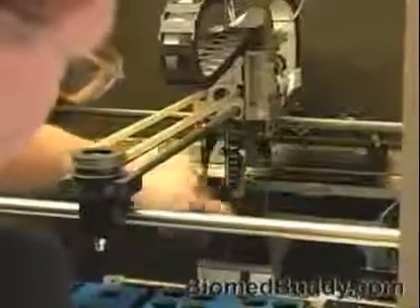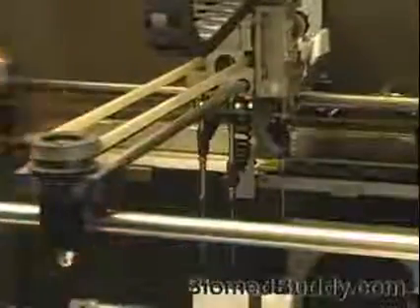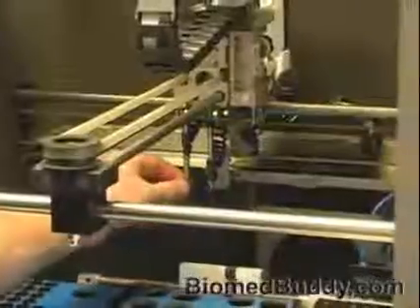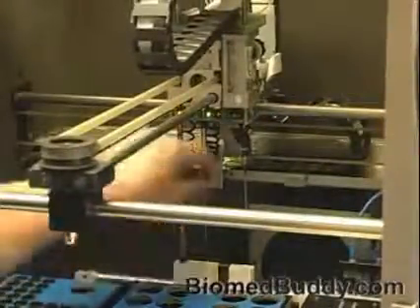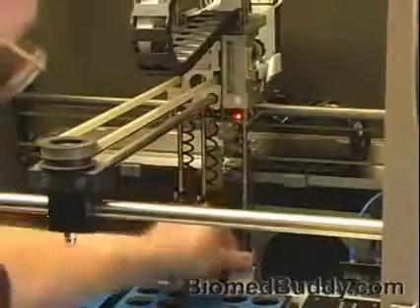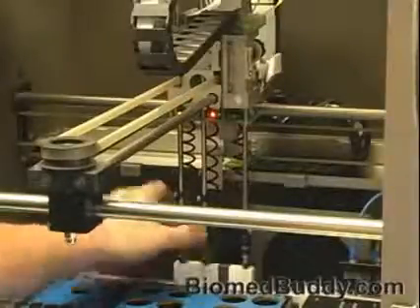I'm going to raise my needles up and take the mapping cuvette out. Alright, now I'm going to lower all 3 needles into the wash well. I'm going to go all the way down with all my needles. Now that is not where we're going to leave them. I'm all the way down.